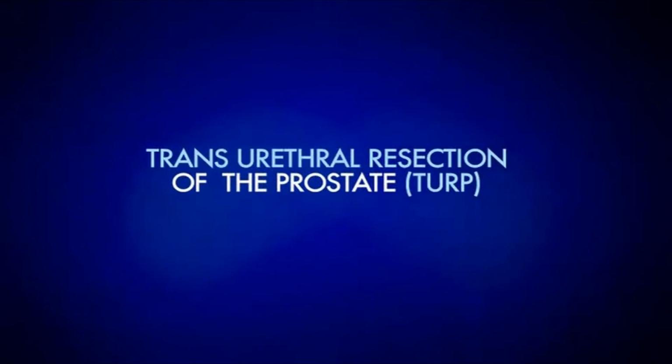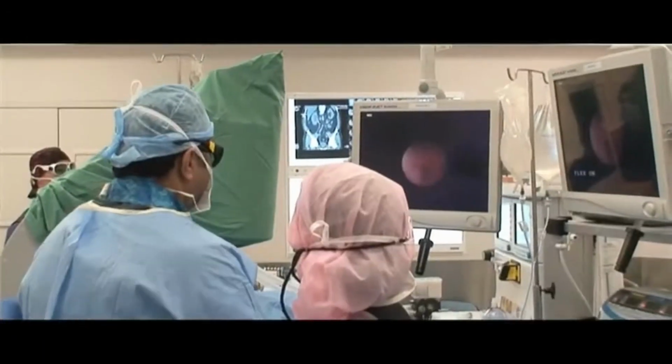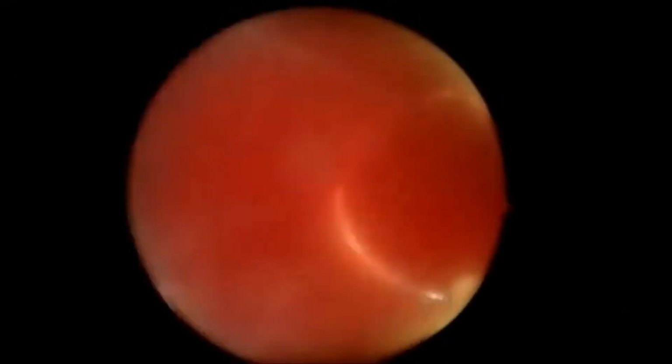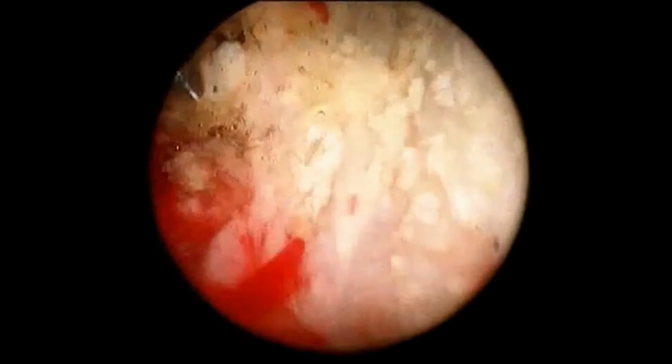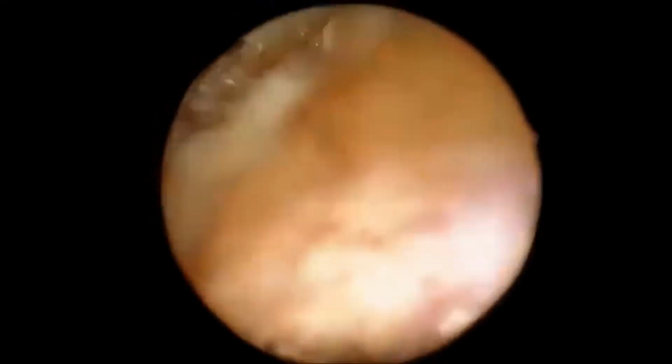The classic treatment is the standard transurethral resection of the prostate. What happens with that is we put a telescope through the eye of the penis, we cut away little chips of the prostate until you have a clear channel. You can think of it like an apple, and I was taking the apple core a little bit more out.